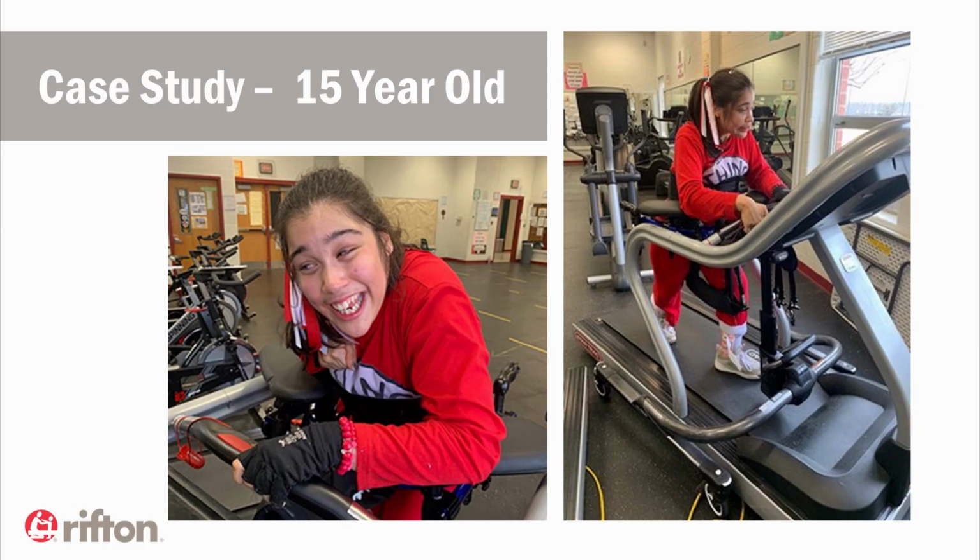Here is an unpublished case story contributed by Connie Johnson. She's a school-based PT in Fairfax County Public Schools in Virginia, and she compiled data with one of her students, Rachel, a 15-year-old with cerebral palsy. So she was independent with the use of a motorized wheelchair, but only used a gait trainer during adaptive physical education class or to access the bathroom maybe 300 feet a day.